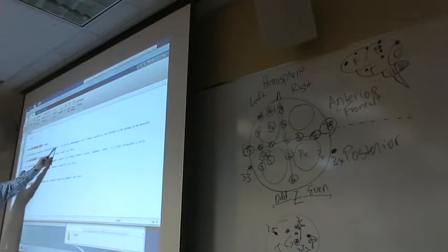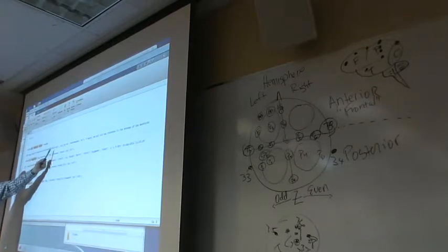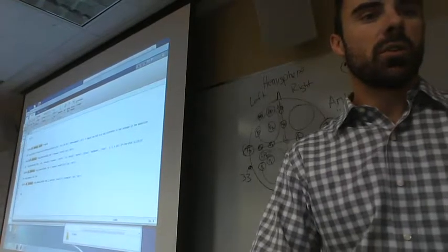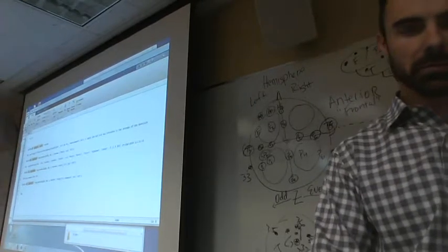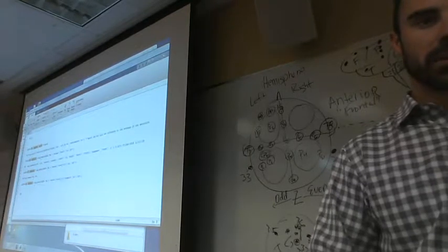Okay? So I'm going to teach you a couple ways to change it to allow this to be changeable. And we'll do that every time that there's a 4, which is also in all of our files that we save our names as. Okay? So follow with me and do as I'm typing in here. What we're going to do is delete that 4. Press the space bar.